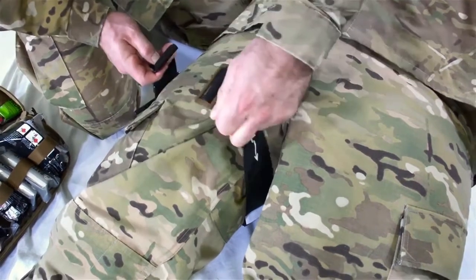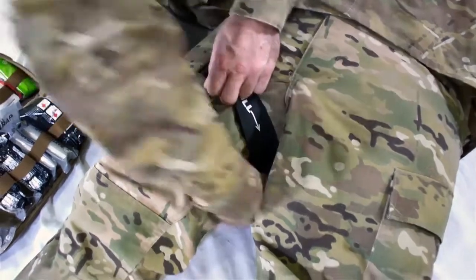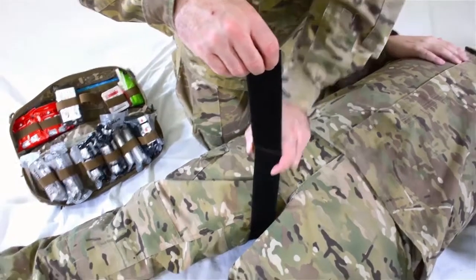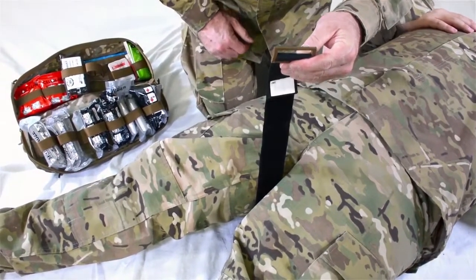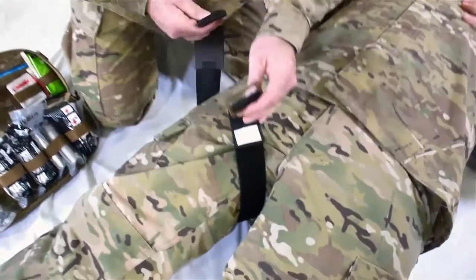If the TMT does not fit around the extremity, pull the time tab until the tail is separated from the velcro, then adjust the buckle to achieve the required length. The TMT preset circumference fits the 5th to 95th percentile for lower extremities. Use a sawing motion to put the device in the high and tight position.